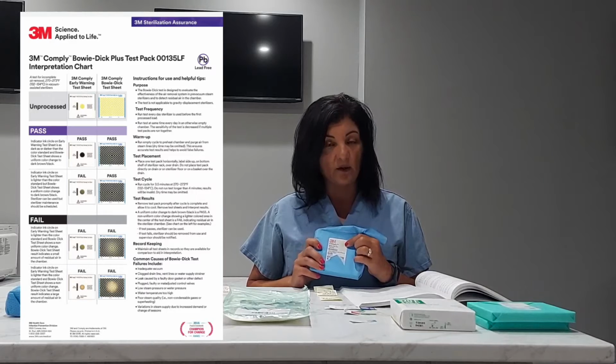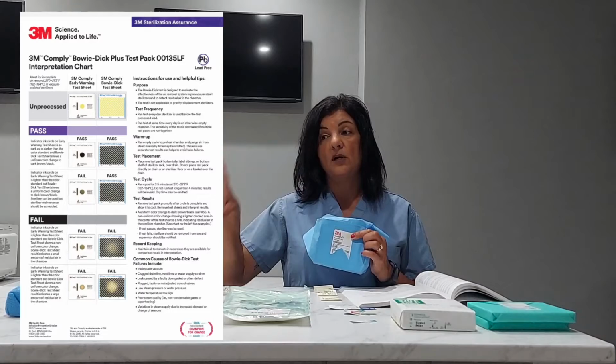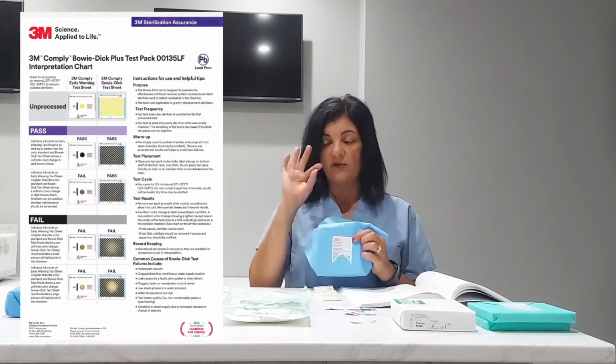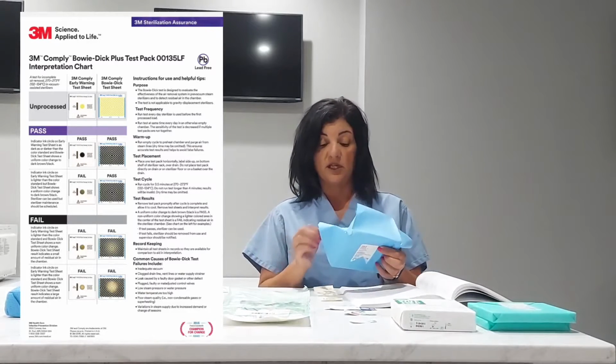When you open these up after, first, I know this has not been exposed to sterilization because this yellow dot, or this class 1, is still yellow. Once it's been exposed to a sterilization cycle, this dot turns black. Again, it's my first visual to know that this has or has not been exposed to a sterilization cycle.